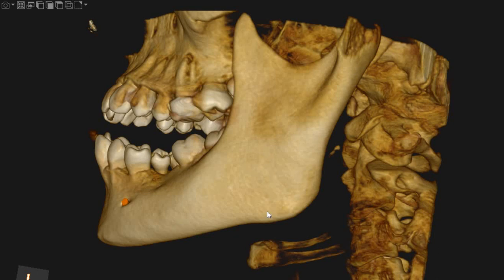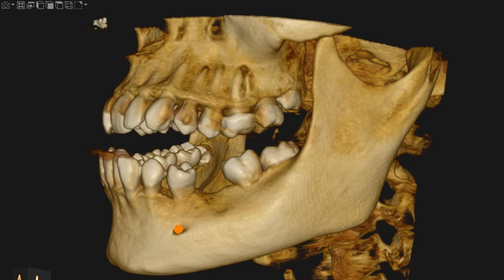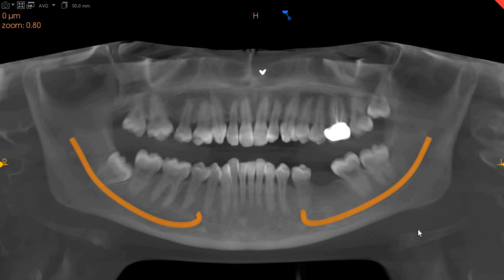Hello and Assalamu alaikum, Ultra Scan Diagnostics here. This is the CBCT of a patient which you had requested. The area of interest is the lower left eight and its relationship to the inferior alveolar nerve, as you can very clearly see right here. The apex is close to the inferior alveolar nerve at this point.